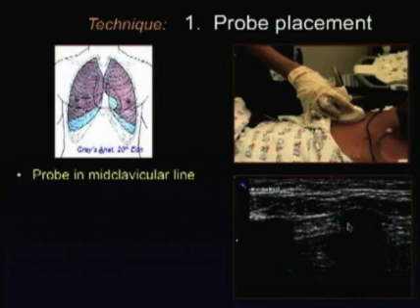And based on the ribs and the rib shadows, we're going to use that information to identify the pleural line, which once it's shown seems quite easy to recognize, but it should be noted that there are several other lines here that could be a source of confusion. So it's important to rigorously define the rib and the lower extent of the rib if you can, and the line that runs underneath them is the pleural line, which we're going to be examining.